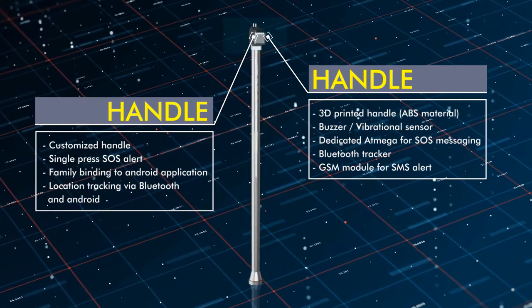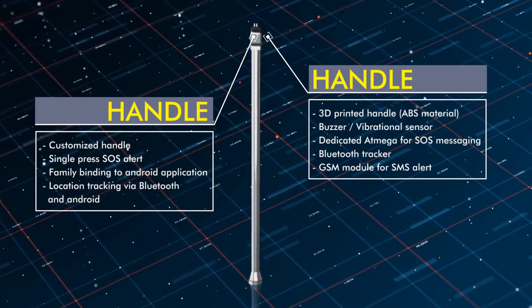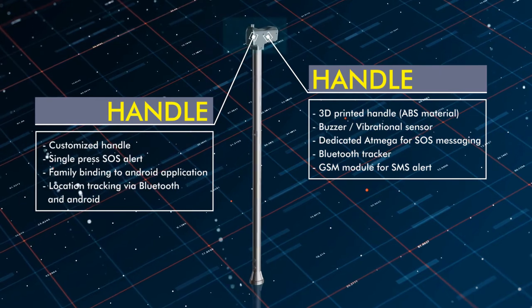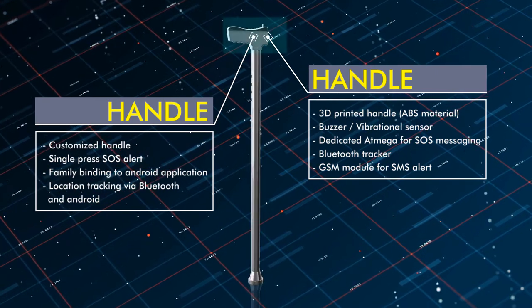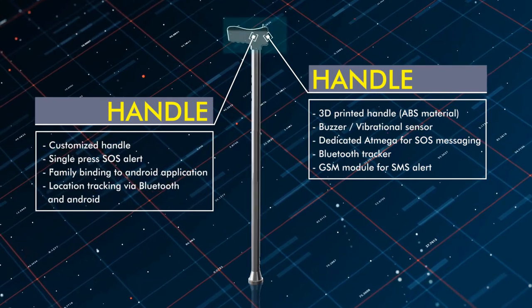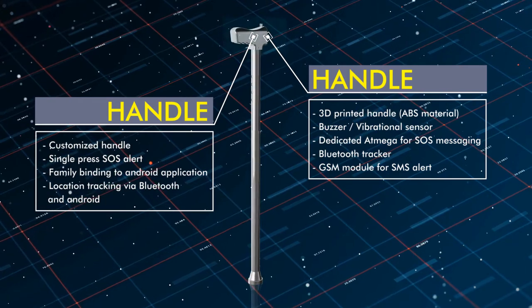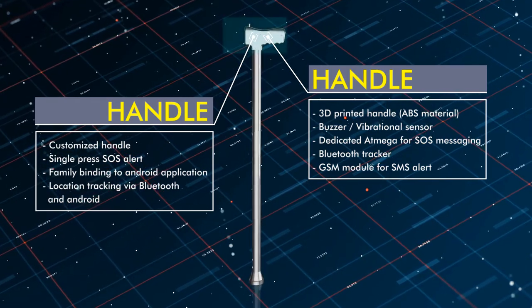We have two important sensors at the handle: a buzzer sensor and a vibration sensor. The buzzer and vibration sensor help the user to identify obstacles on the path by giving pulse feedback. This pulse feedback varies as the distance to the obstacle changes.